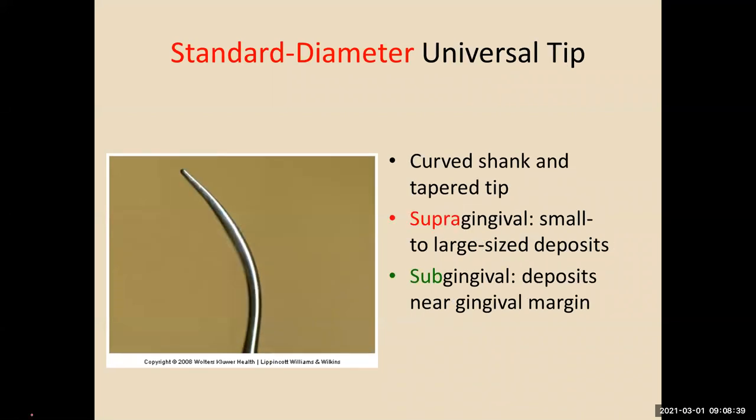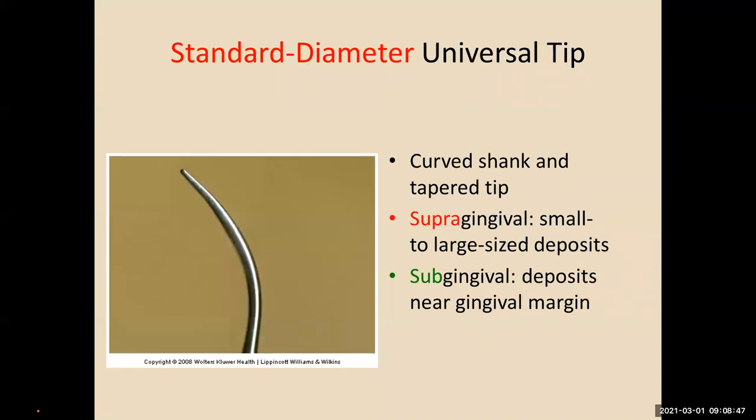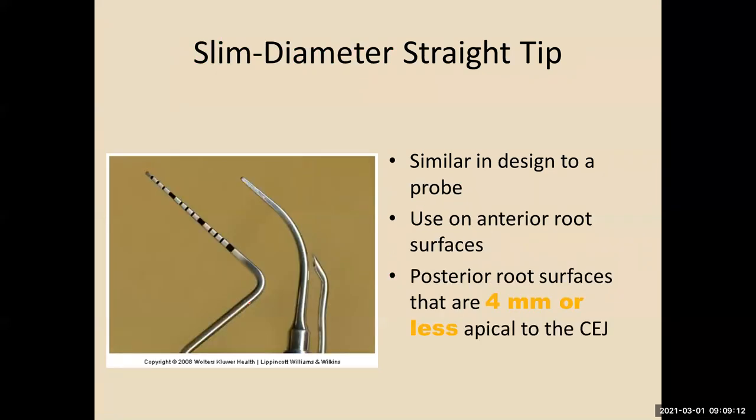You have your standard size universal tip. So this one would be your blue, and then you've got a green for subgingival deposits near the gingival margin. But this is still pretty thick here, so it's not made for deep pockets. You can get slim diameter straight tips, extended shank designed longer. We're talking perio tips here. This is your purple tip.